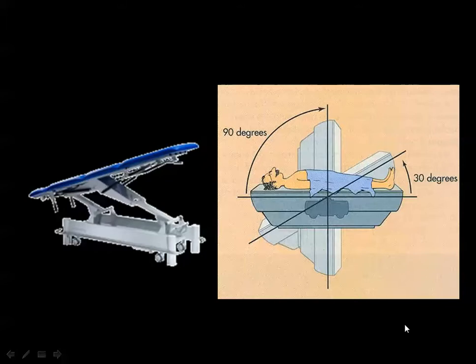Then after introduction of the contrast material inside the spinal canal, if you are aiming at the lumbar spine, then go ahead to have the radiographs in the supine and erect position. But if you are aiming at any other segment of the spine, you should tilt the table so that the contrast media will pass from the lumbar spine into the dorsal or the cervical spine. Then you reposition the table and have your films.